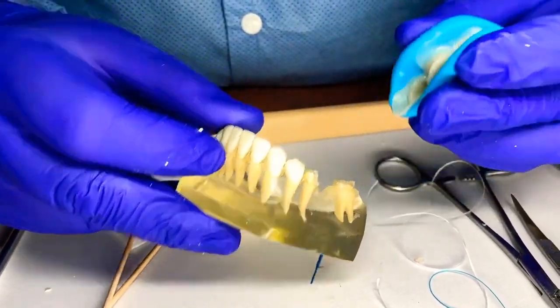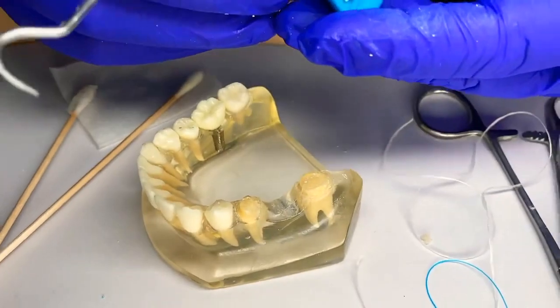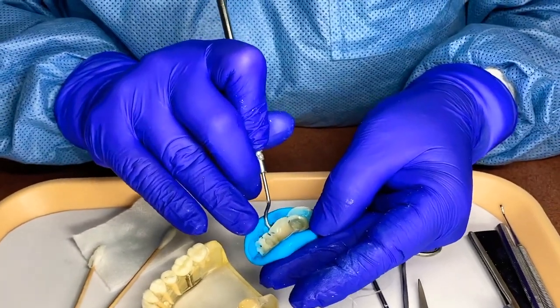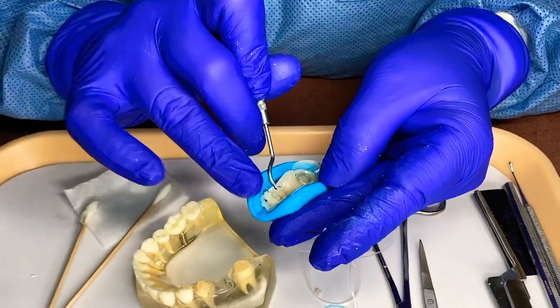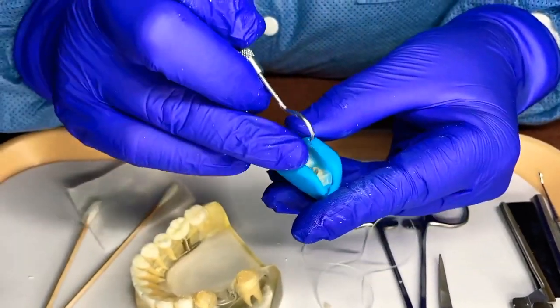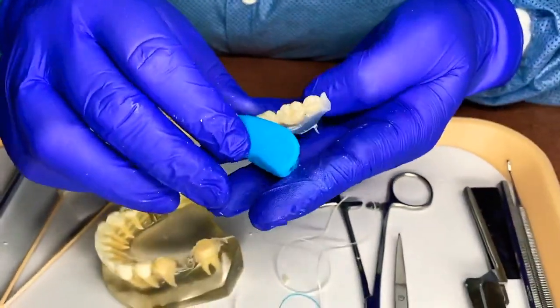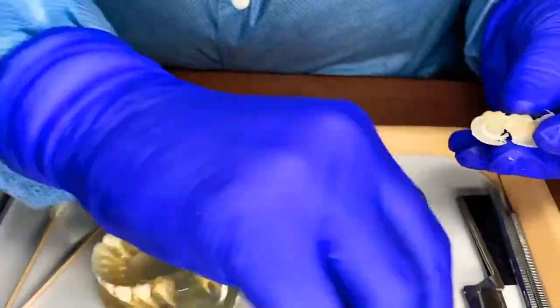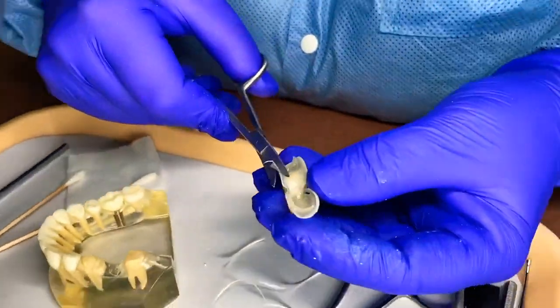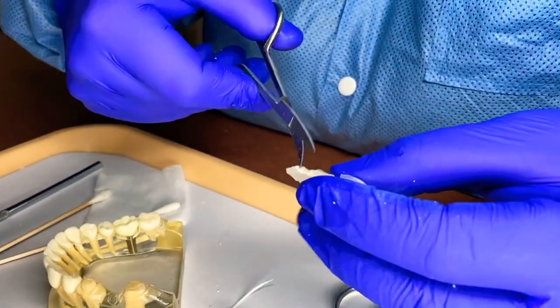You can kind of pull it off gently. It might leave the temporary behind — that's fine. There we have our temp. You can take your explorer and remove it from the bite. We can use our knife — always have a fulcrum when using a sharp instrument, especially in a patient's mouth, for stability. We can take our scissors.